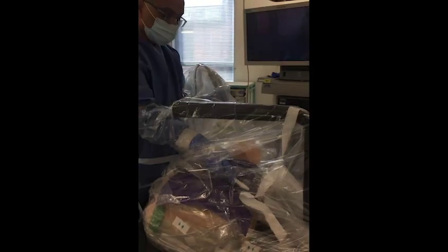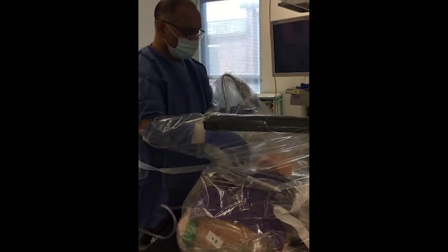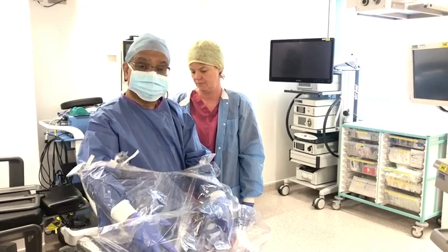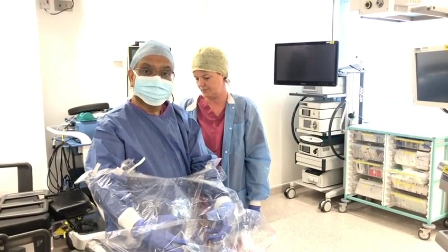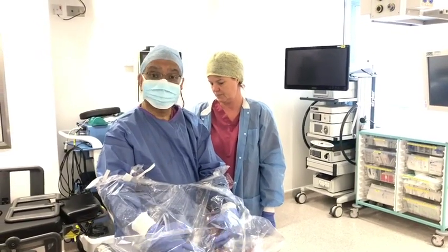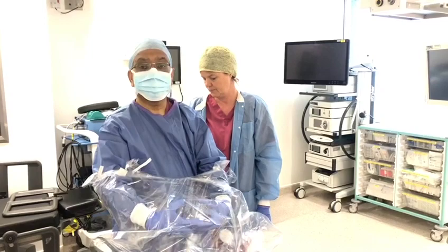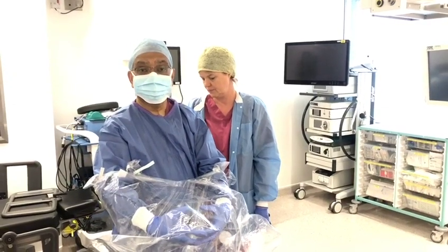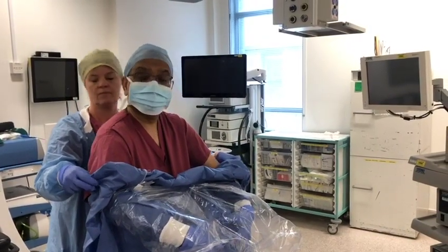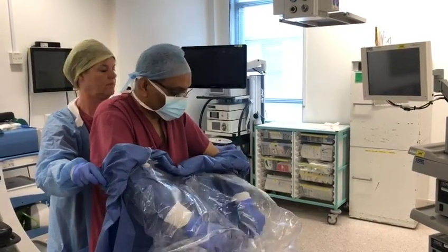You can pick up the instruments and perform a basic sinus surgical procedure. This is not a full seal, but at least it provides some protection against aerosols. Doffing — that is, removing the tent in a safe manner — is critical. We suggest the surgeon wears two gowns, so the whole tent is removed along with the outer gown to minimize aerosol exposure. Doffing is important: the outer gown comes out and the assistant rolls out the outer gown.